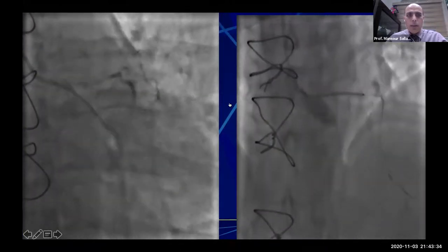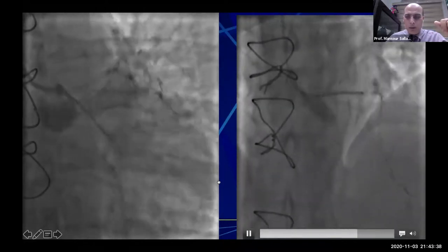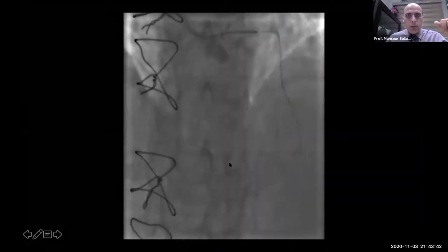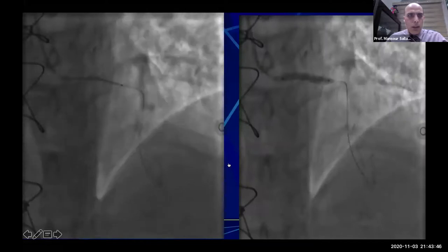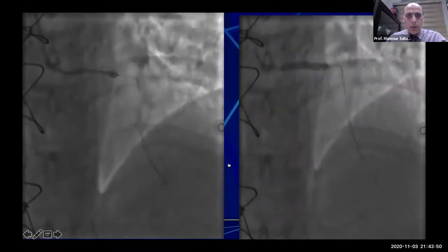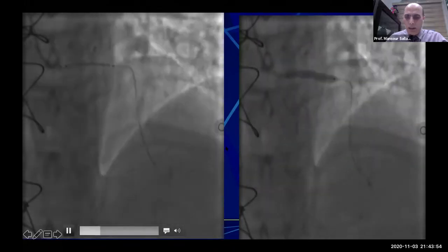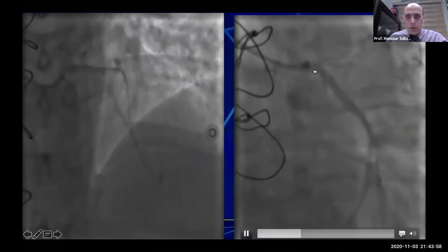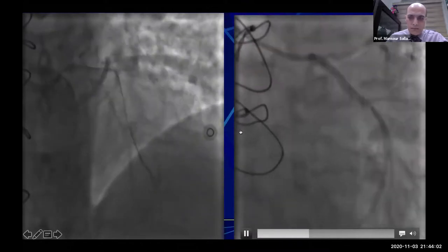Okay, so I used the 3.5 stent based on the distal diameter of the LCX. Precisely deployed, centered and deployed precisely from the ostium of the left main to the distal LCX, and dilated. Also, I think good flow in the distal, it becomes well perfused right now.